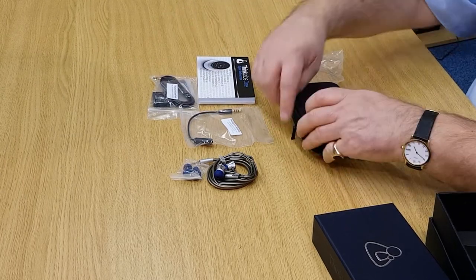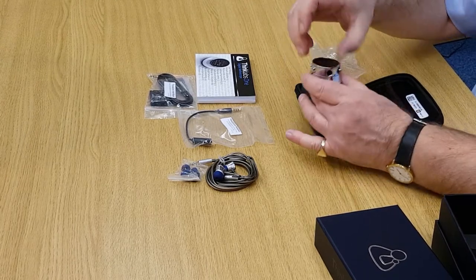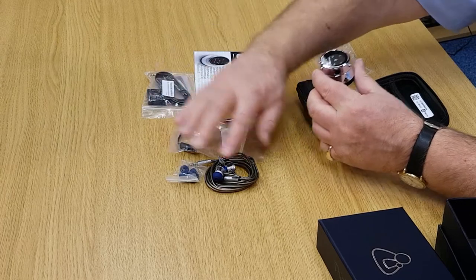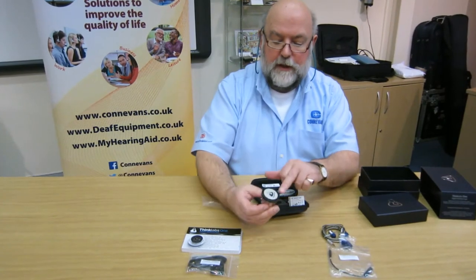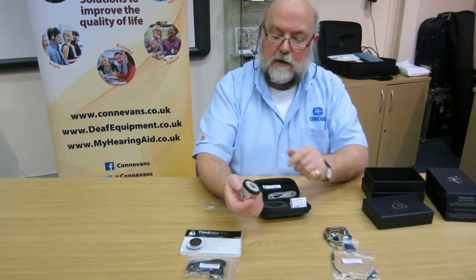So let's look inside the actual box. And here we have the Think Labs One stethoscope. You'll need to recharge it before use. There's the normal part — that's the diaphragm of the stethoscope.